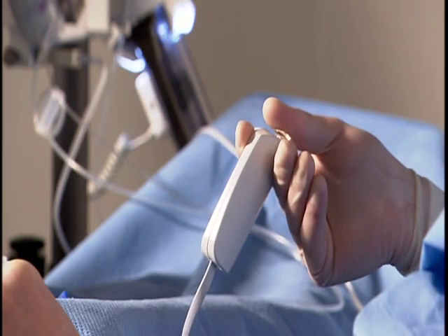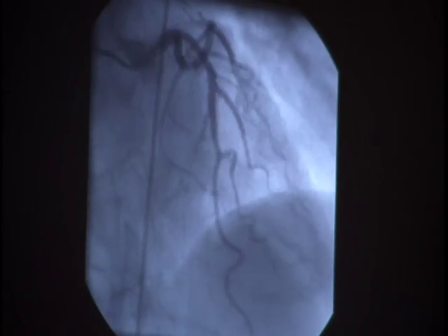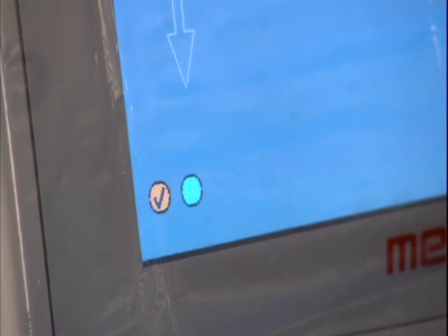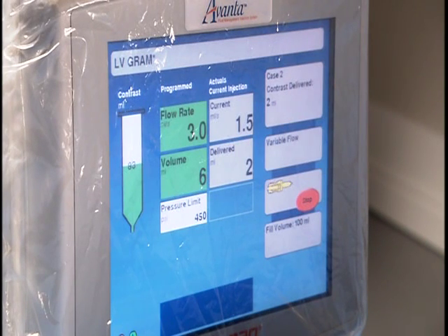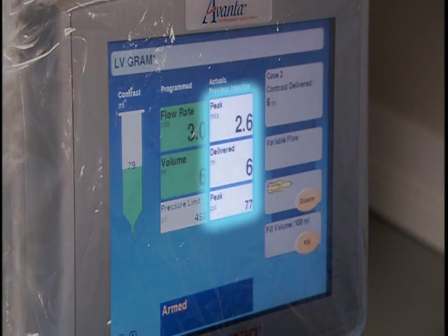Initiate the injection by depressing the hand controller until the desired opacification is achieved. The fluid delivery indicator flashes green when injecting contrast and flashes blue when injecting saline. The volume remaining syringe icon decreases during the injection. When the injection is complete, the injector will automatically rearm, an audible tone is generated, and the actual flow rate achieved, volume delivered, and PSI are displayed.